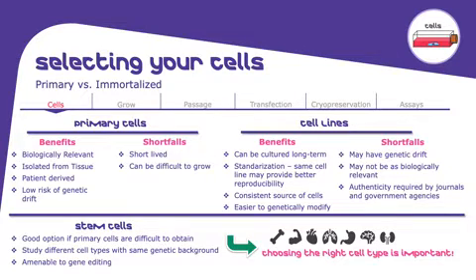After that, you would need to acquire new cells. Cell lines, or as we call them, immortalized cells, can be cultured for a very, very long time. They are a very consistent source of cells and pretty easy to modify as well. However, they also do have a limitation.